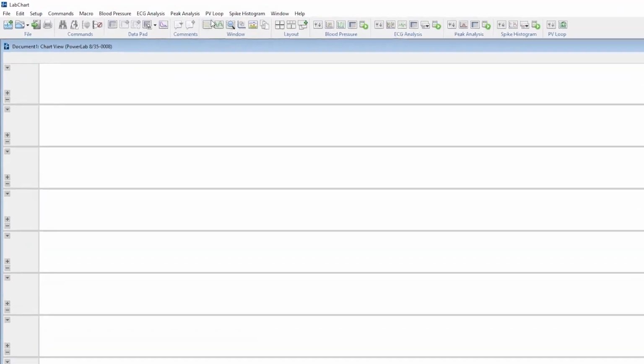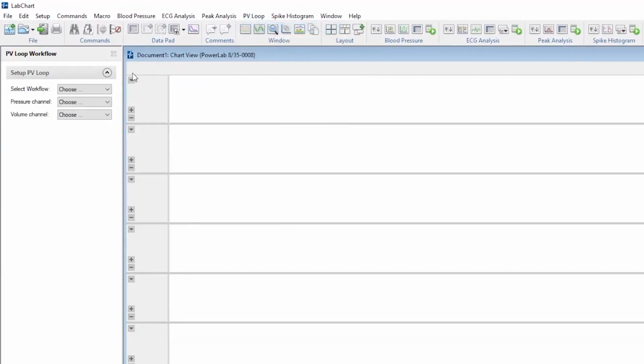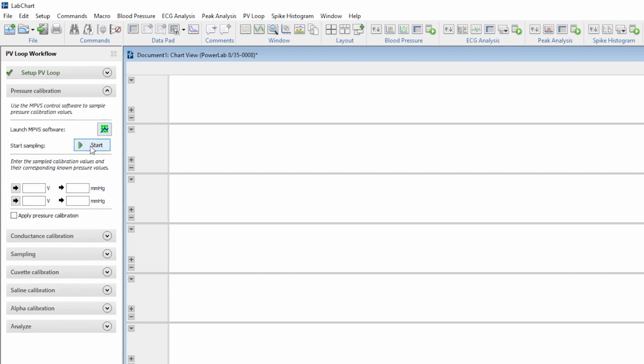In LabChart, select the PV Loop menu and check Workflow. This will open the workflow window on the left. First select the workflow. In this case, it's small animal. Next, indicate which channel in LabChart is the pressure channel and which channel is the volume channel. Now go to the next item in the workflow list, pressure calibration. Click on Start Sampling.